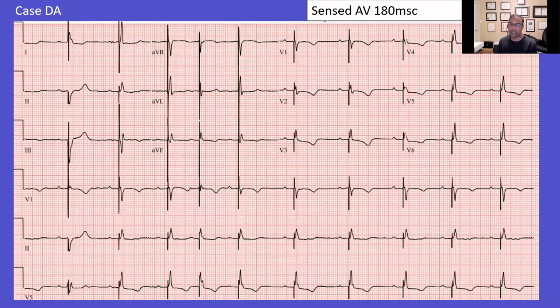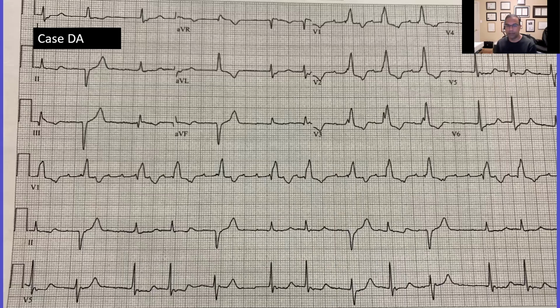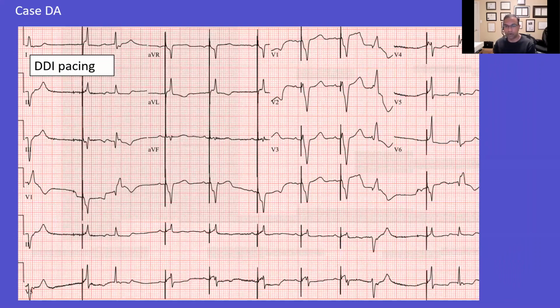So changing that AV delay is an important thing to consider, especially when you have these sick, diffuse conduction system disease patients like this one, this case. That pre-ECG was awful looking. There was a lot of conduction system disease. And if you just give up without optimizing the AV delay, you'll end up with your DDI morphology, which is still a huge improvement over what you had before, but it's still not optimal. And when you play around with the AV delays, you can really improve it.